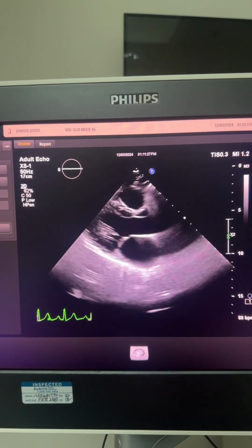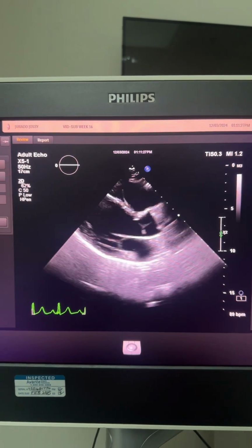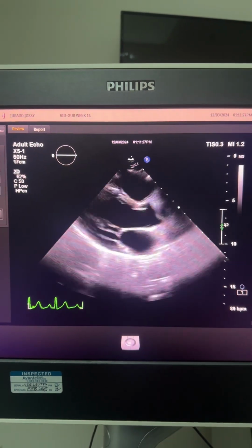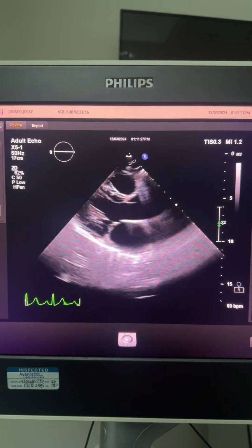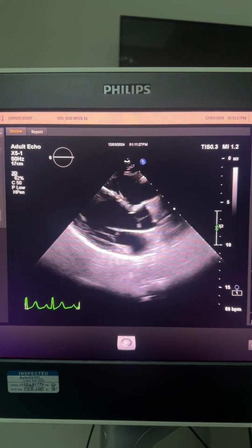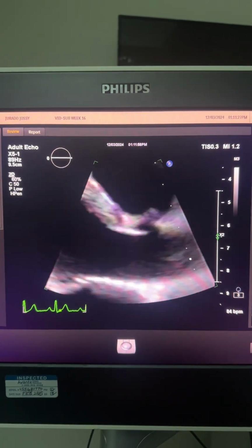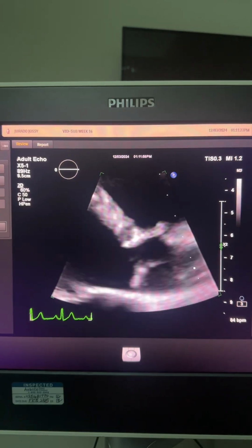This is my video submission week 16. For this protocol, I did the aorta protocol. Here I start off with an increased view of the PLA, as well as a decreased view, and a zoom view of the LVOT.